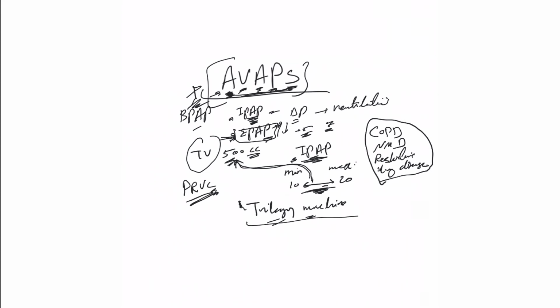we use it only in the outpatient setting, so you won't see it in acute inpatient settings. You may see it in the hospital for somebody who has it at home and brought it with him, or if the pulmonologist decided to discharge them on this machine.